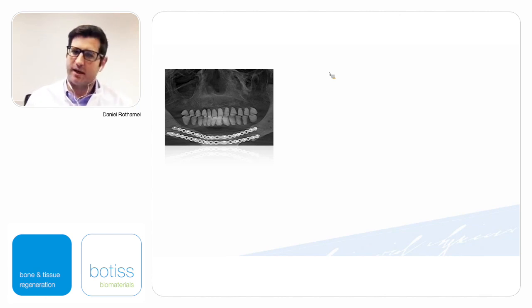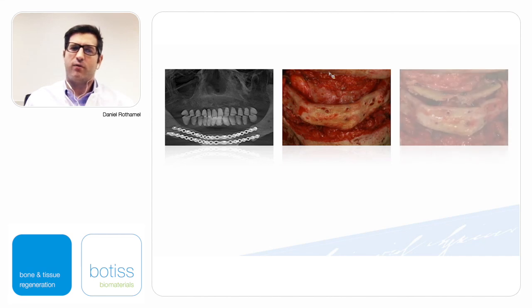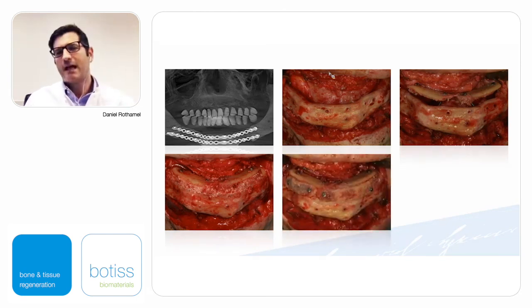1 year. So the patient is asking for prosthetic rehabilitation, but the scapula doesn't provide enough bone for installing the implants. So we have a very limited bone. It's vital bone. It's a nice rehabilitation, but we don't have enough height and enough width for installing the implants. So we're using hip grafts in combination with some bone substitute materials. In this case, it's maxresorb, a synthetic bone substitute material, and we are doing a large vertical and horizontal augmentation.